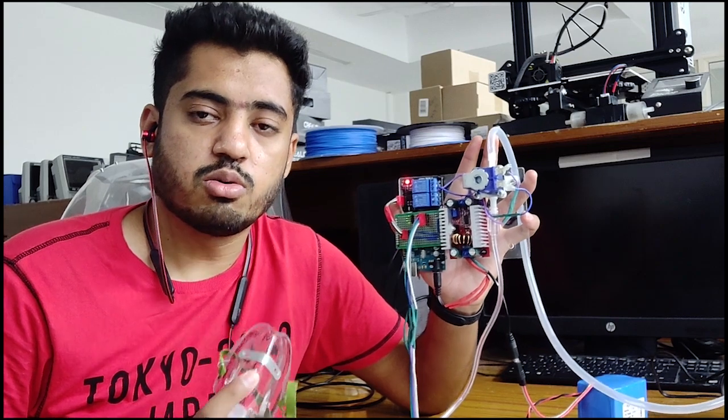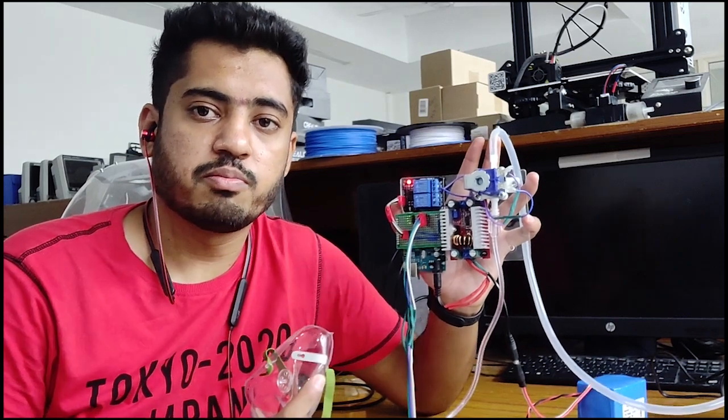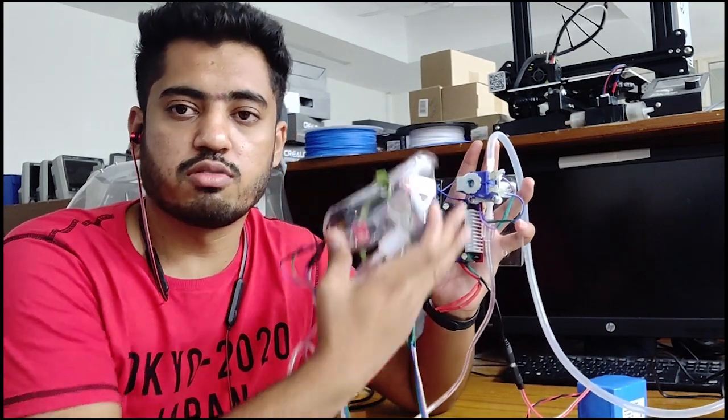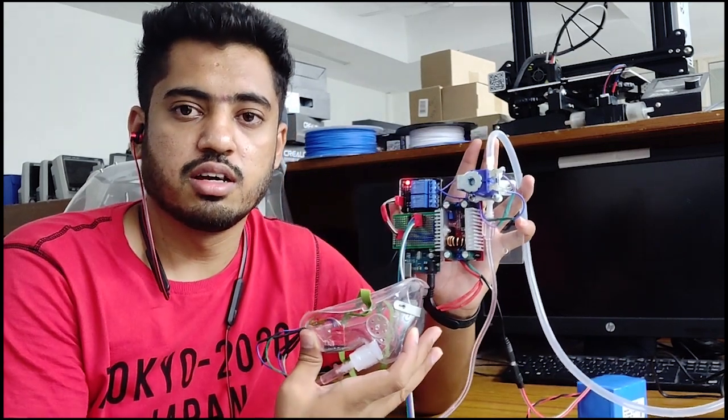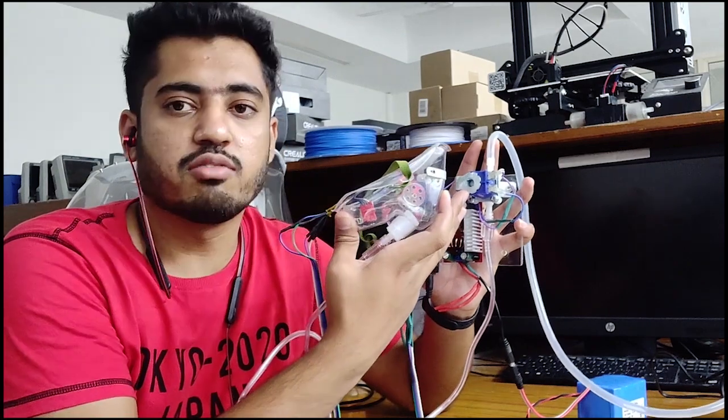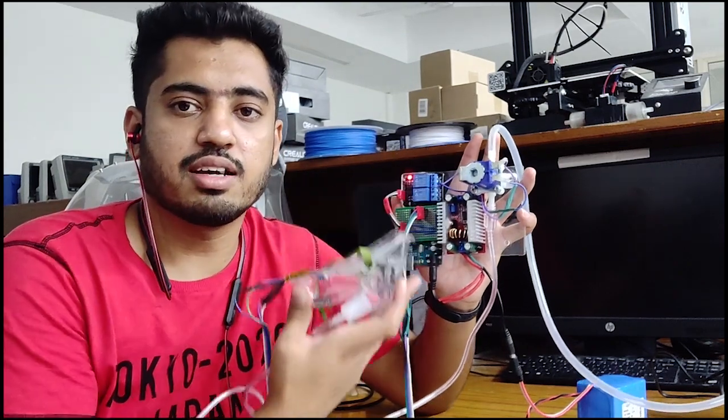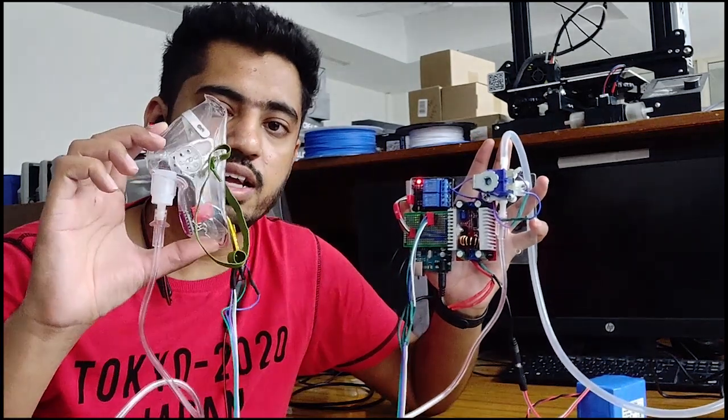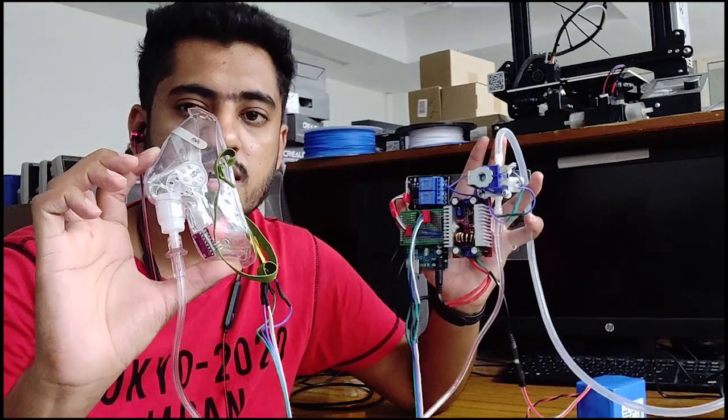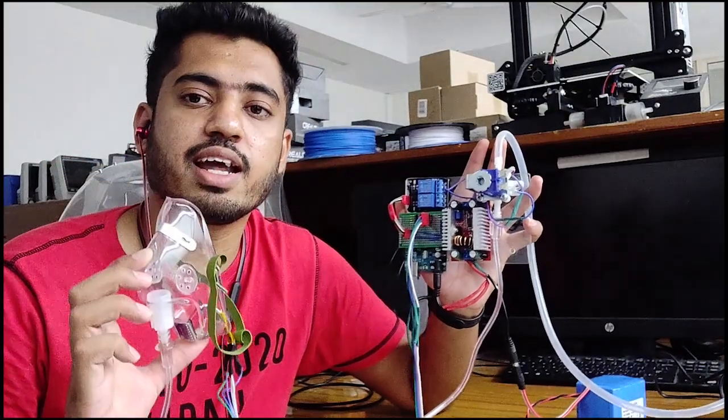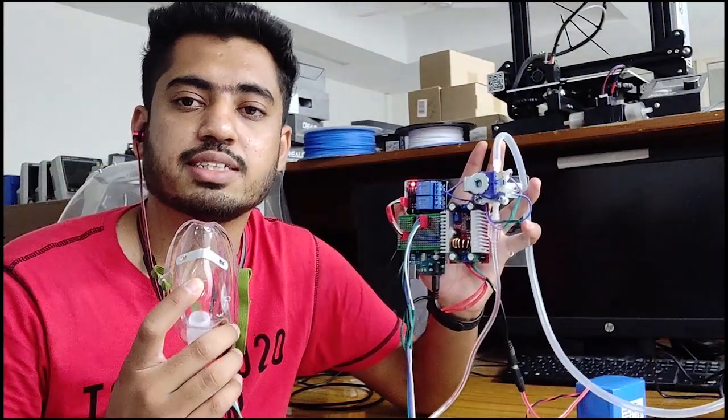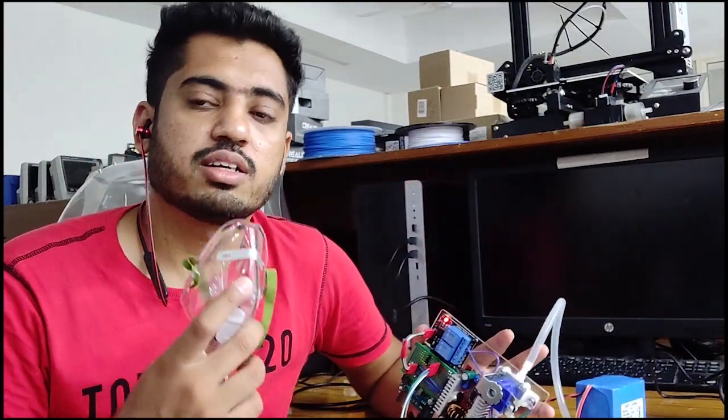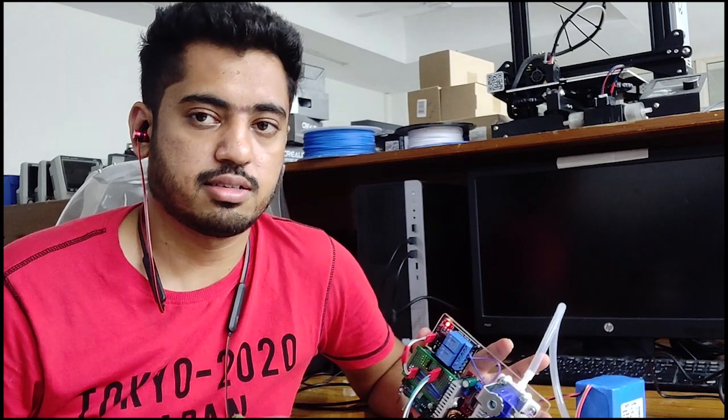So in our system, we are smartly controlling the flow of oxygen using this solenoid valve and a microcontroller unit. A sensor has been installed in the mask that will detect whether a patient is inhaling or whether he is exhaling.